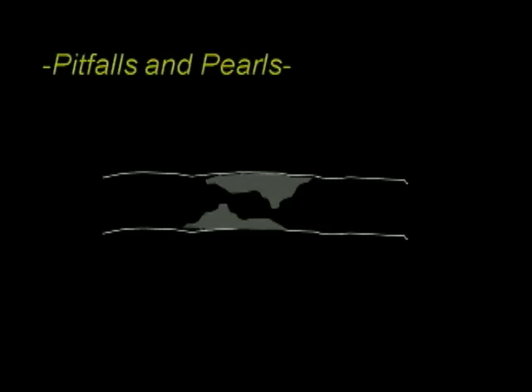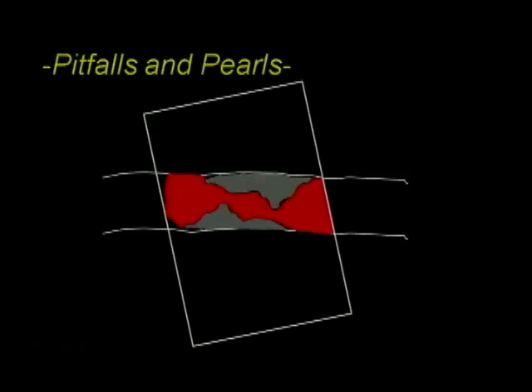One of the other things I would caution you to do is to not put on the color flow when you acquire your blood flow velocities. Here, an example of a carotid artery with a plaque, and most people will turn the color on and then place the sample volume. Here's your beam angle, and then the Doppler cursor.